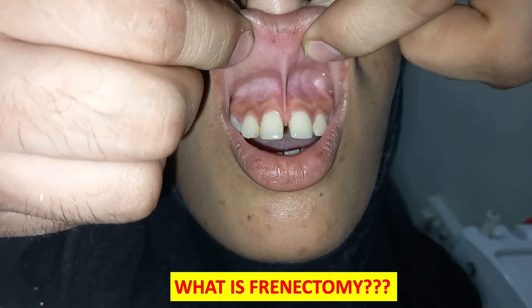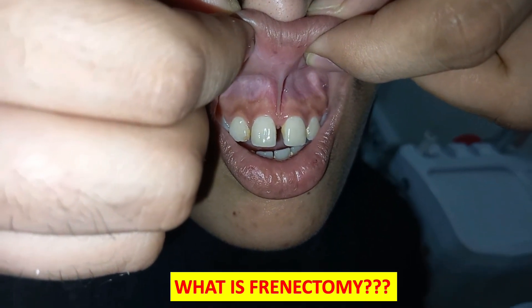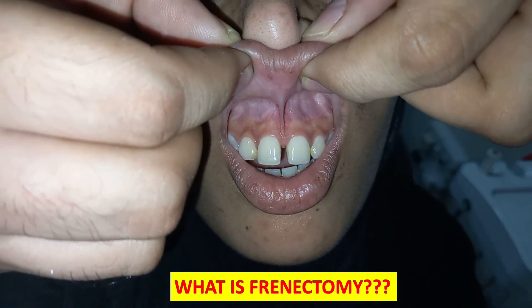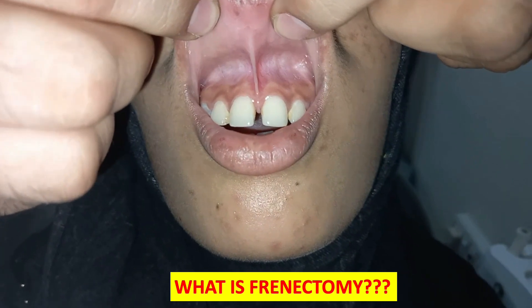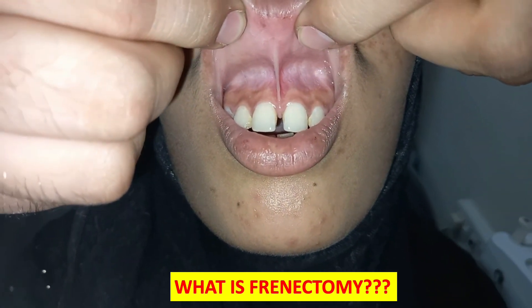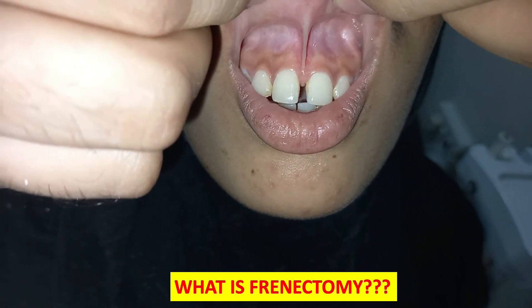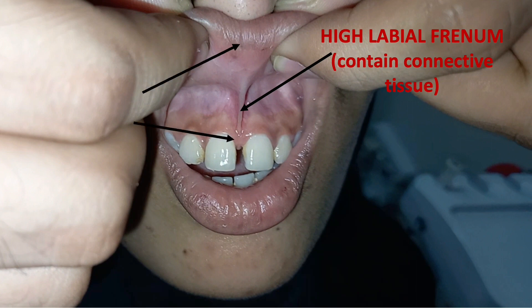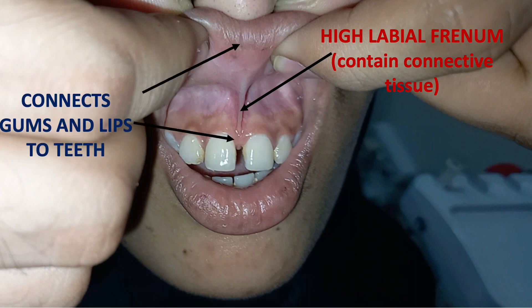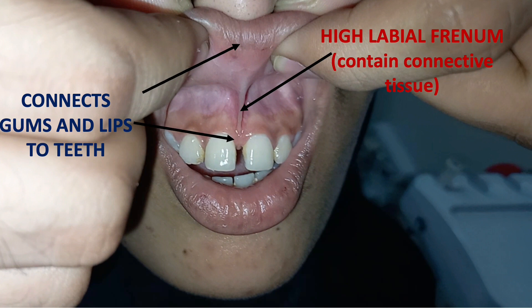First of all, what is frenectomy? As you can see in the video, this is a classic example of high labial frenum, which is very common. Frenectomy involves the removal of connective tissue in your mouth known as the frenum. As you can see in the figure, it connects your gums and lips to your teeth — a thin connective tissue that connects the gum and the lips. We remove this part so that the pressure created by the tissue is released.